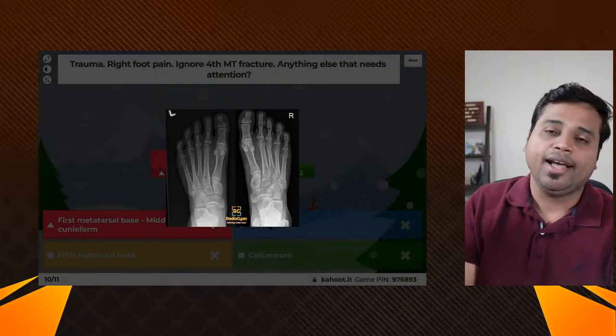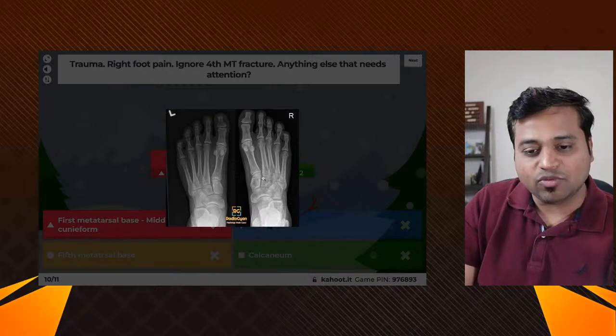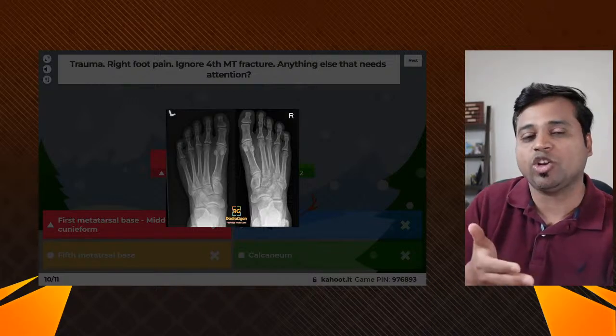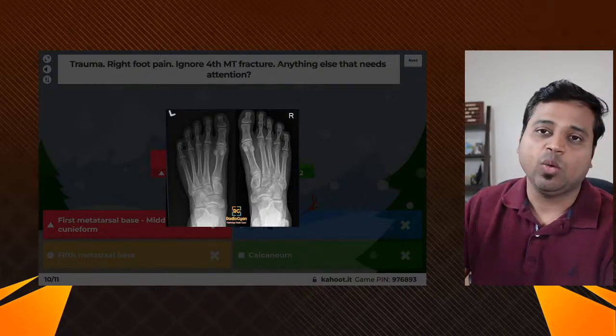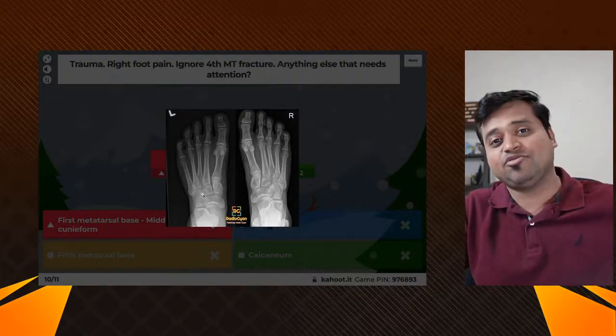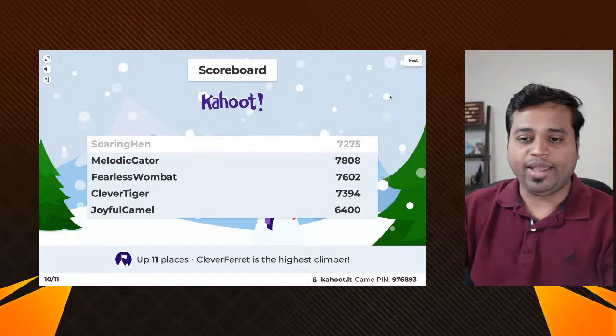So that's where the Lisfranc ligament attaches. And that's where, if you look at the Lisfranc interval here, that's widened as compared to the left. And that's what this patient had. We did a follow-up radiograph with weight bearing, and this accentuated that. And apologies for putting it as first metatarsal. It's not the first metatarsal. Okay.